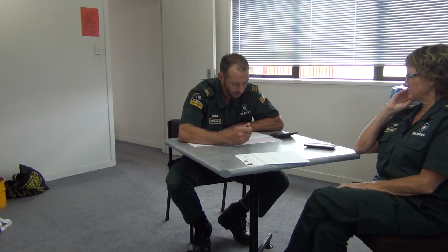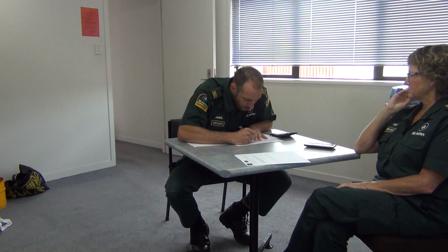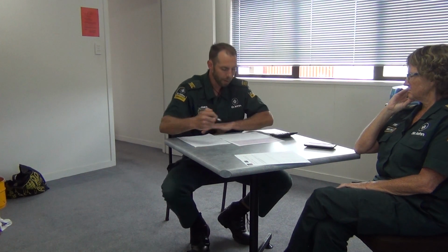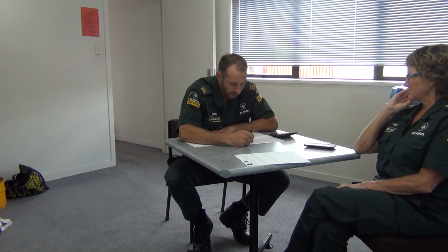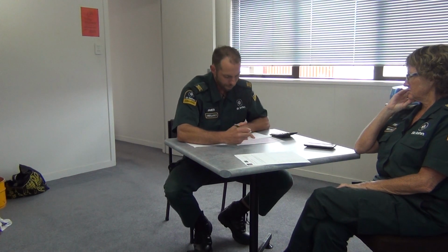We've got depression, which is, just count that, which is about, in V2 it's 3 squares and in V1 it's 2 squares, so there's ischemia there. We've also got some elevation in the anterior lead of V4, which is 1 mil.